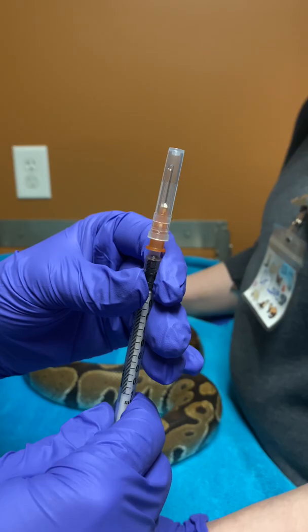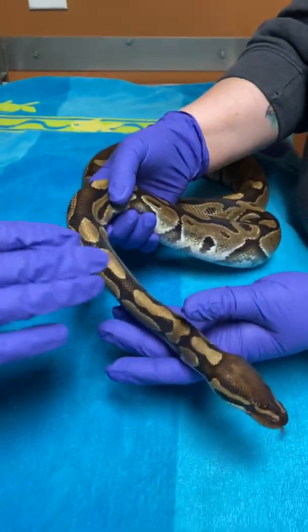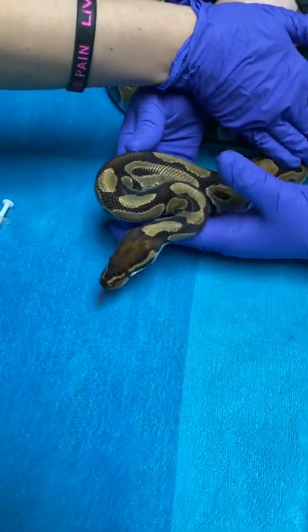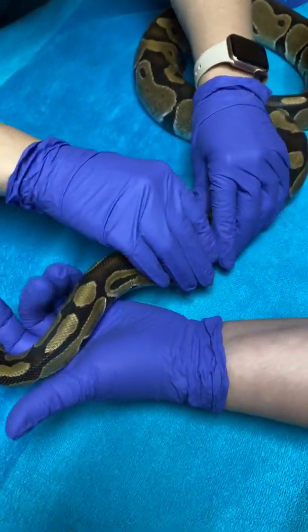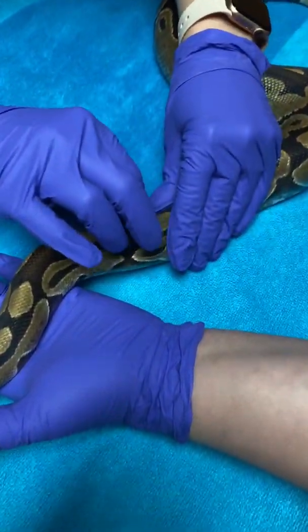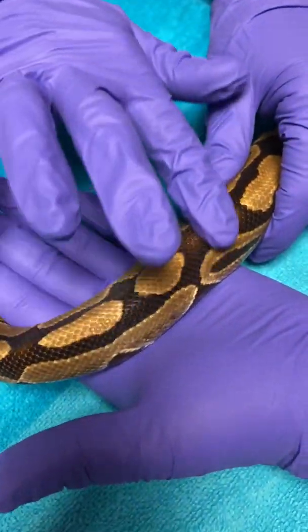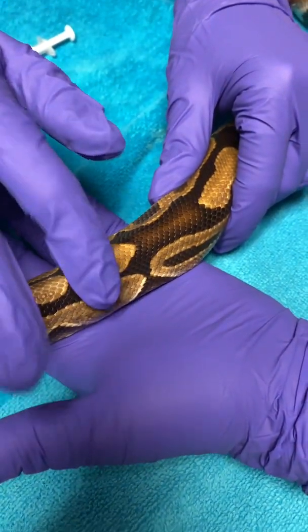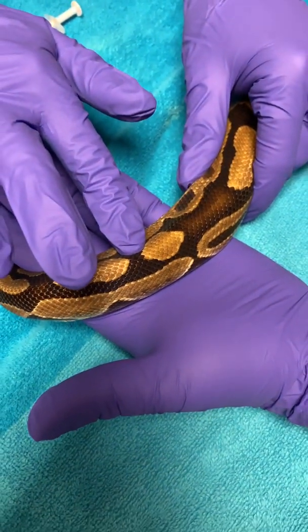In snakes, you want to do the injection on the first one-third part of their body. You don't want to go to the half or the lower half of the body. For intramuscular injections, their muscle is on each side of the spine, so you can feel the spine straight back, and on either side of it there's a layer of muscle where you're going to give the injection.